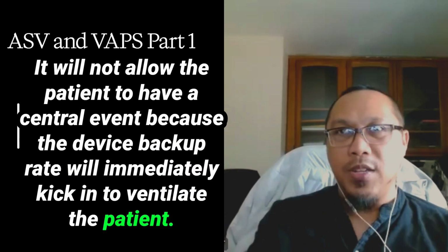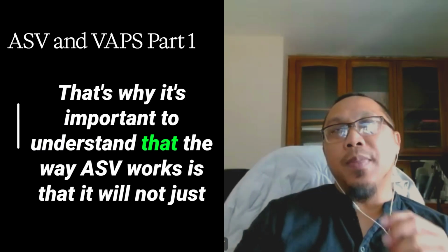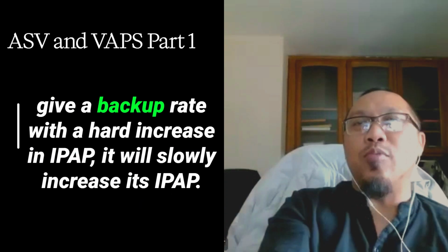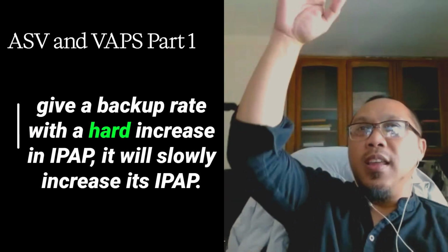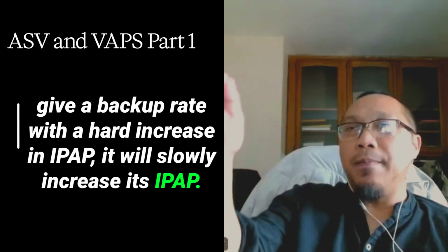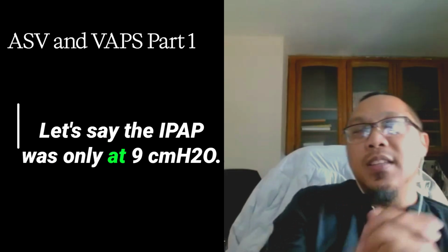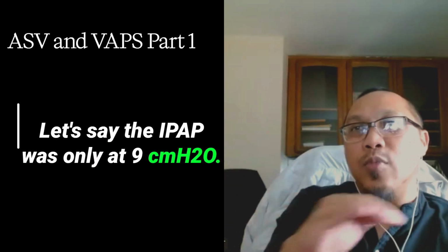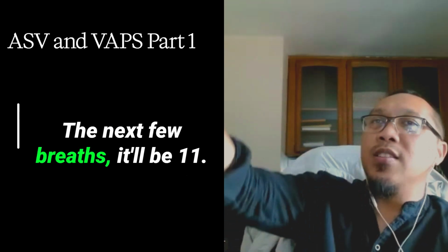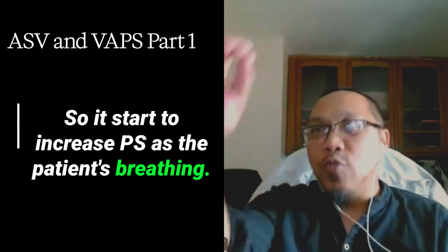to ventilate the patient. That's why it's important to understand that the way ASV works is that it will not just give a backup rate with a hard increase in IPAP. It will slowly increase its IPAP. Let's say the IPAP was only at 9 centimeters water pressure. Then on the next breath, it will be 10, right? And next new breath, it will be 11. So it starts to increase pressure support as the patient is breathing.